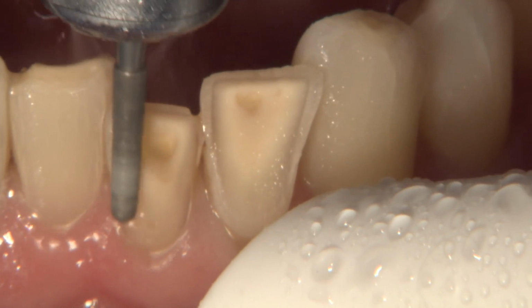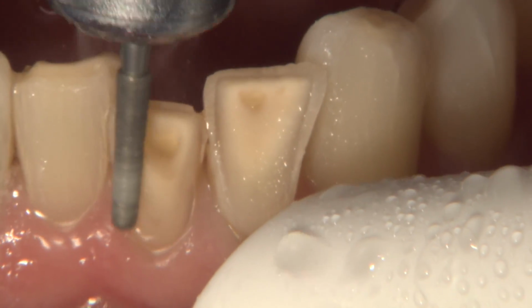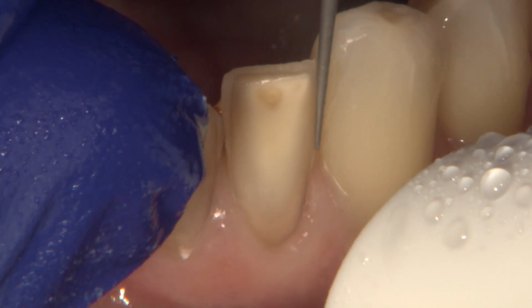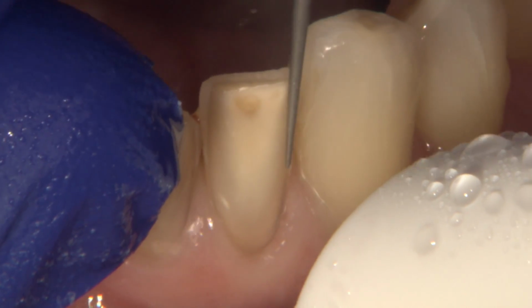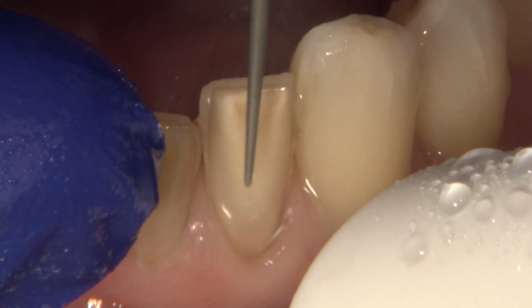Now onto the lower arch, where we complete the veneer preparations on number 23 and 24 that the old PFM on number 9 actually initiated over the past several years. Still with a round-ended tapered diamond, I reduce along the cervical third of the facial and along the interproximal areas.